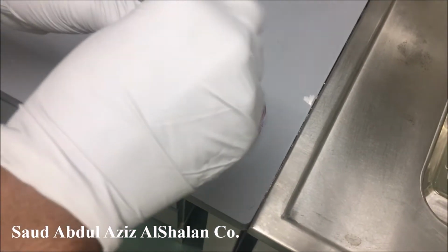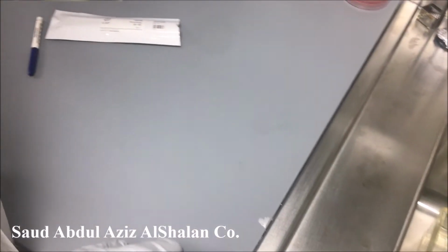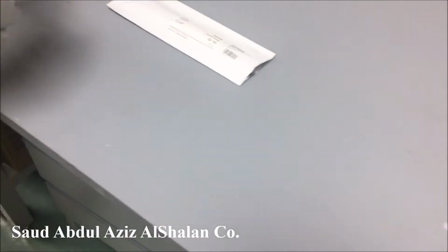Now we're done with the first specimen, which is D15.